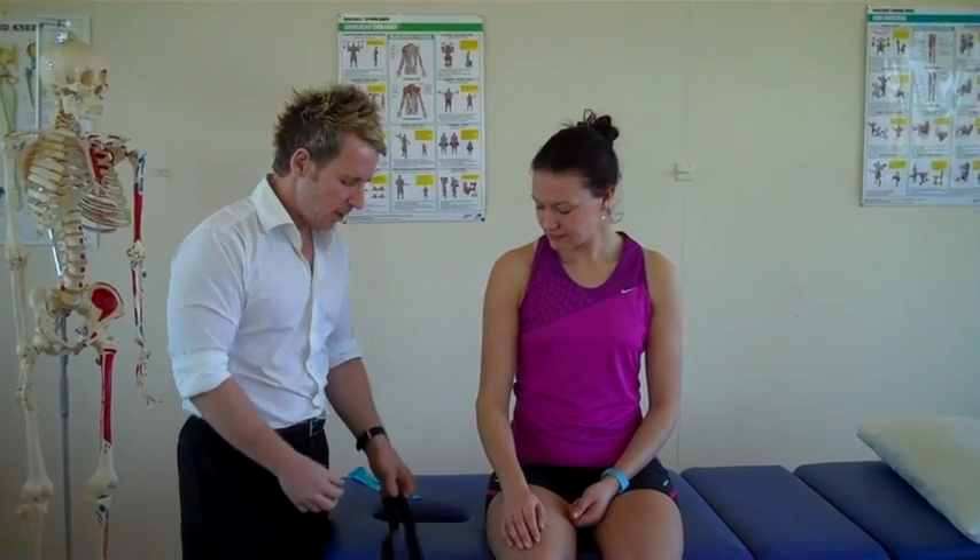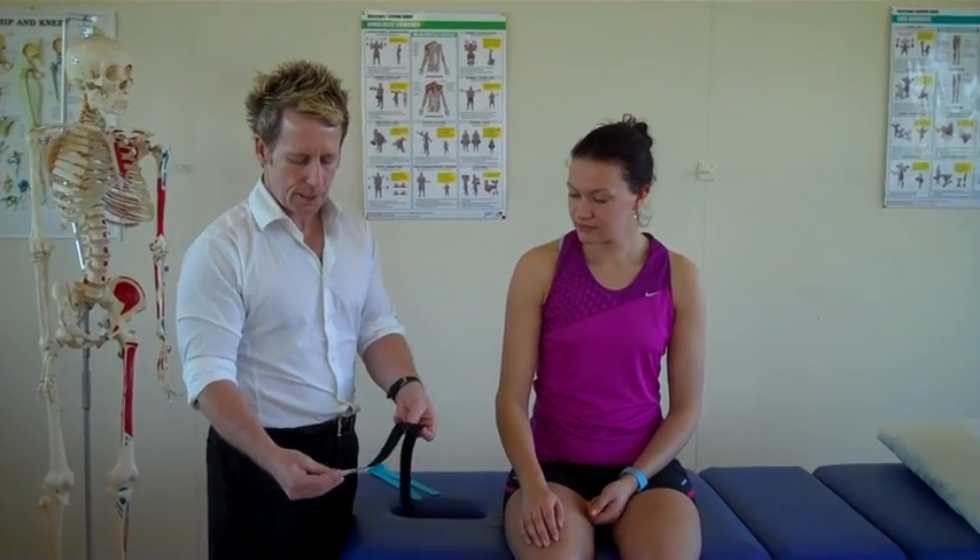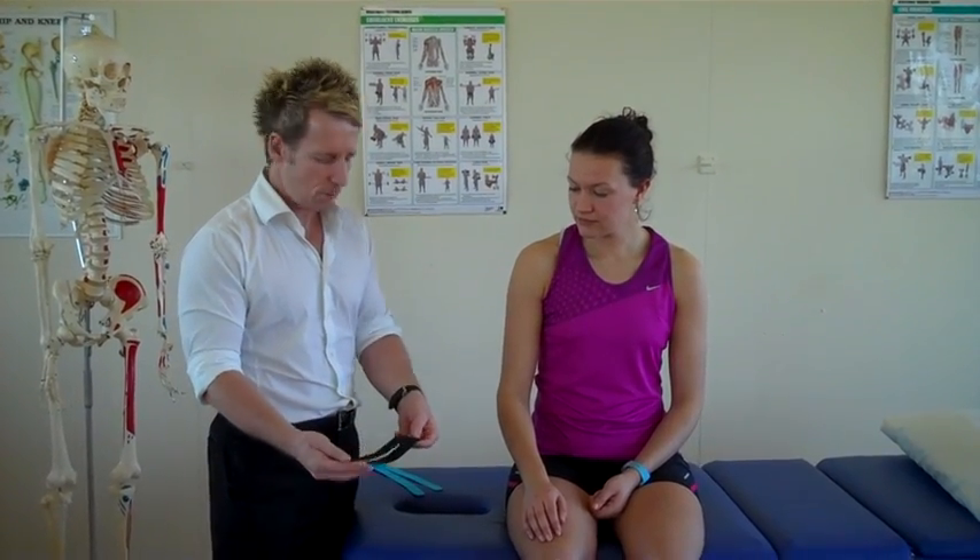What we're going to do is use two standard pieces of I-strip kinesiology tape that we've split so it becomes a wide strip, and we have two of these.